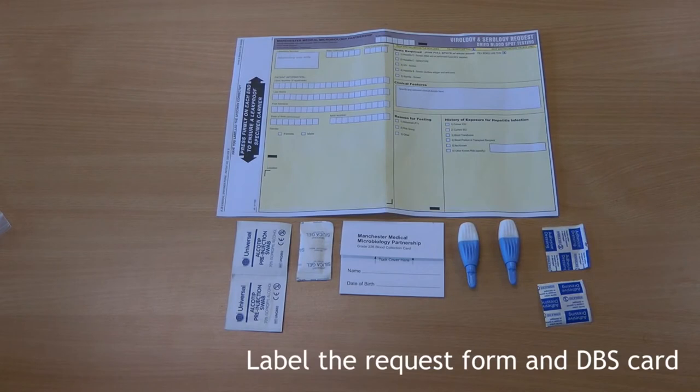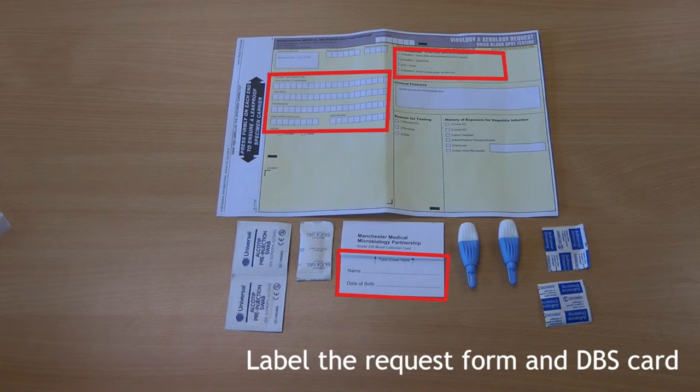Firstly, fill out the request form providing as many of the patient's identifiers as you have available, and enter the patient's name and date of birth on the blood collection card. This is important to ensure we can test the patient's sample and report the results back to you.